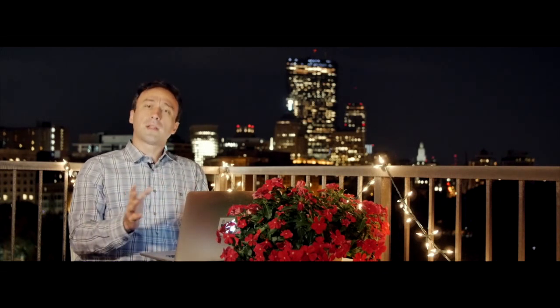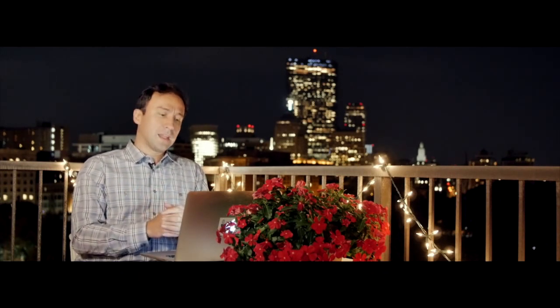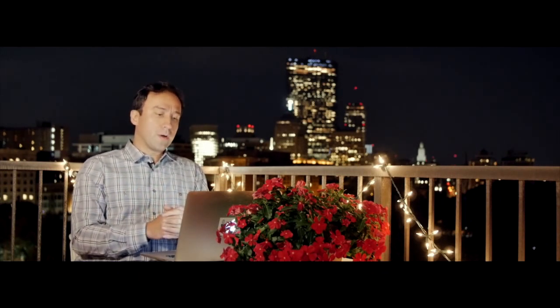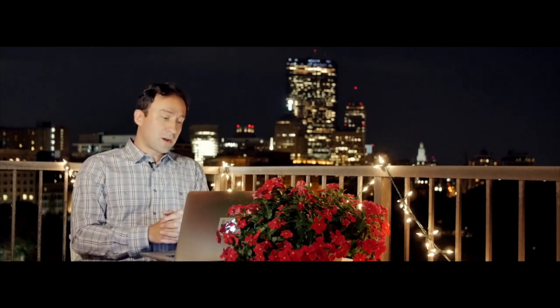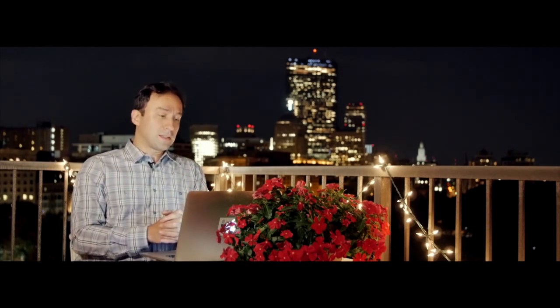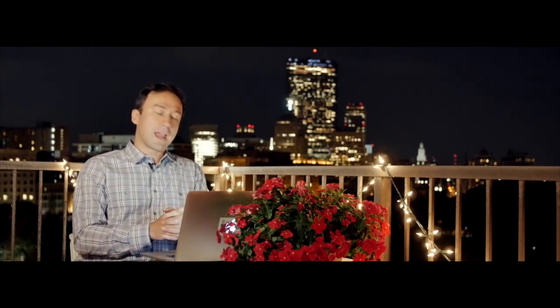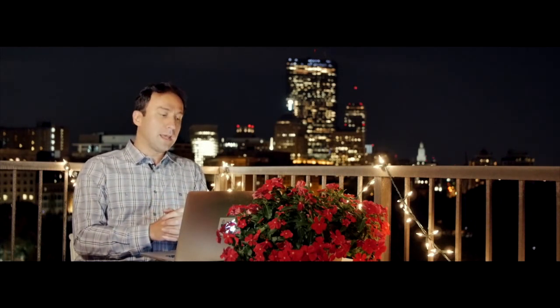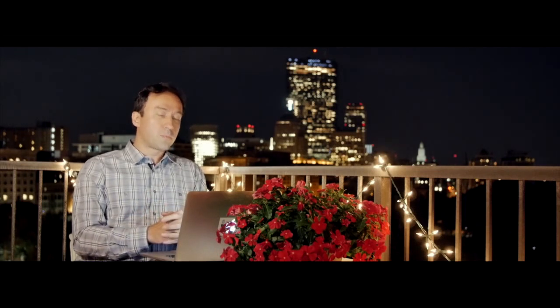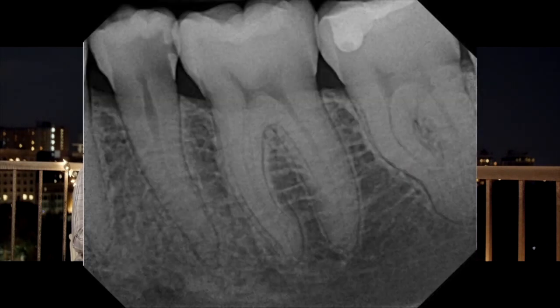So I just wanted to explain that before we get going. Let's get straight to the clinical case I have for you today. This is the case of a lower premolar, tooth number 20, mandibular left second premolar.